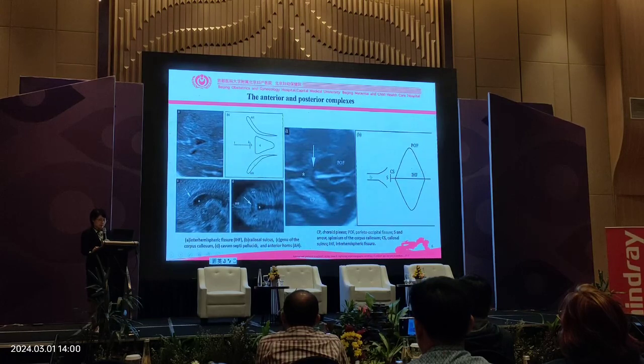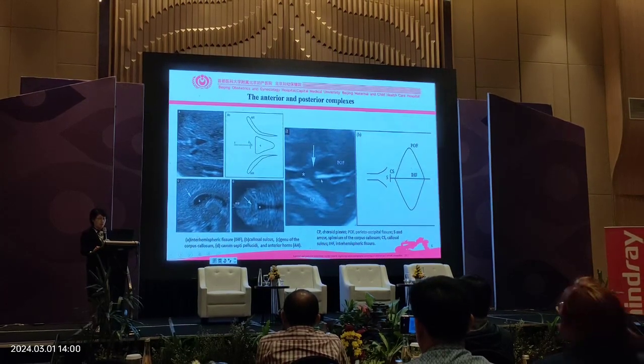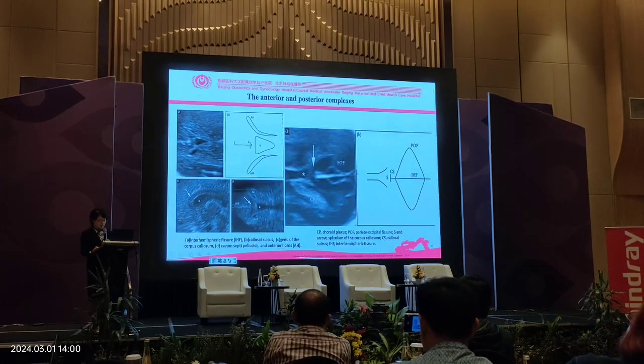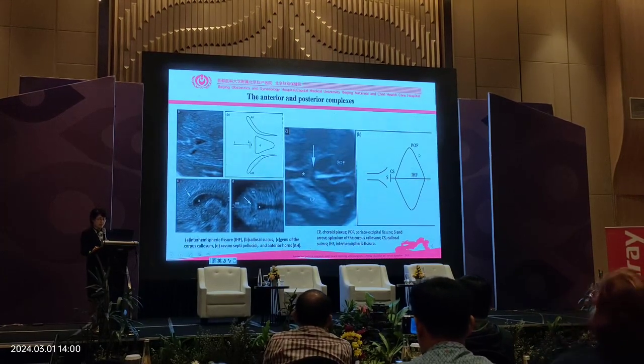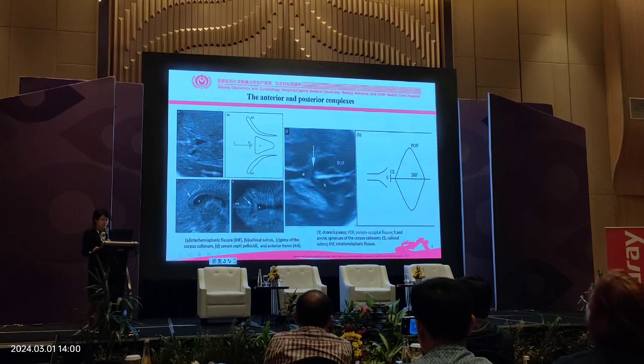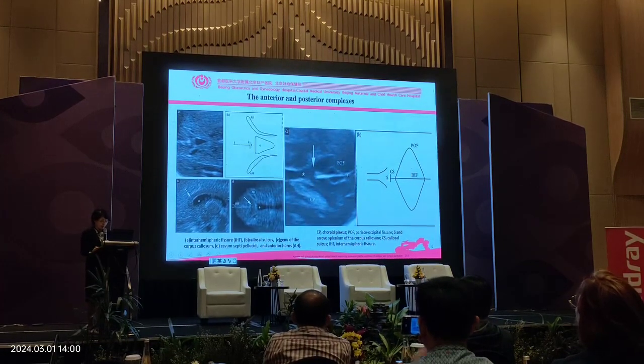And in the midline, posteriorly, we can show the splenium of the corpus callosum and the callosal sulcus, and parieto-occipital fissures here, back here.